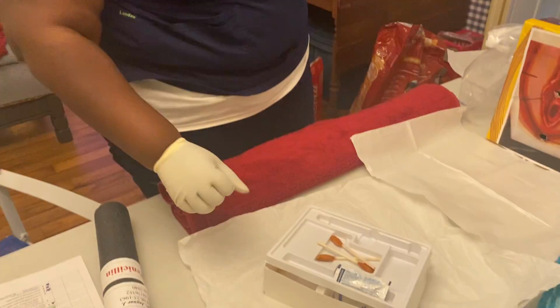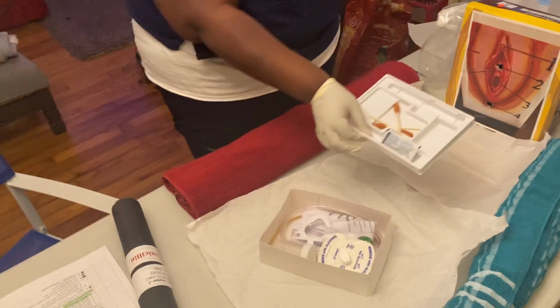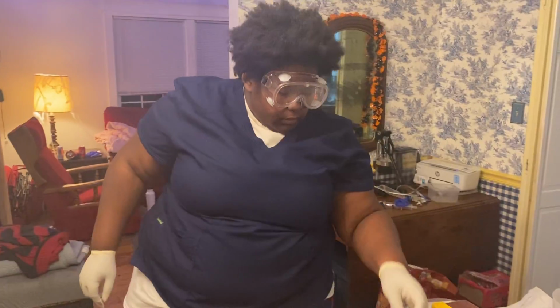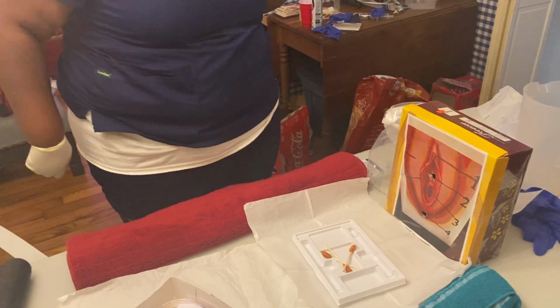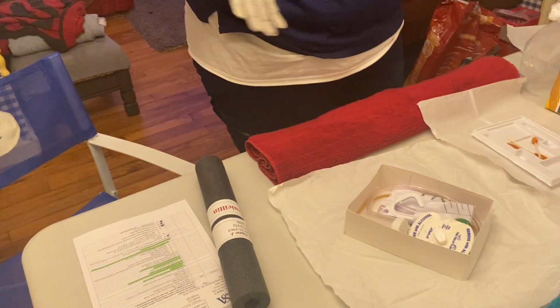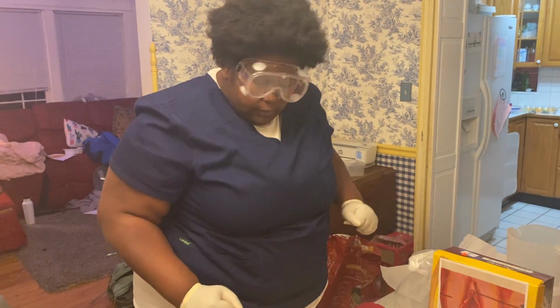Once that is done, I can take this and move it here. I will also take my lube and place it down here. And then I will bring it up above my waist. I would also like to note this table is not waist level, so I am breaking sterility with that.